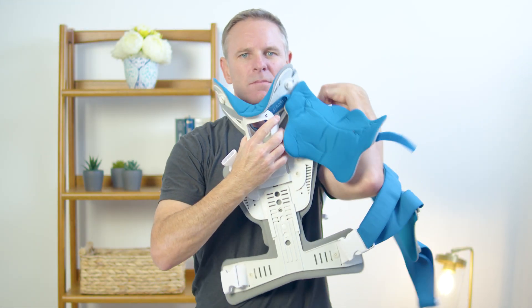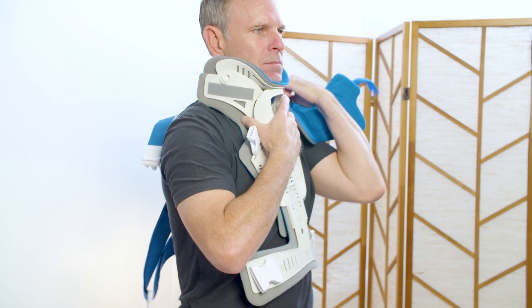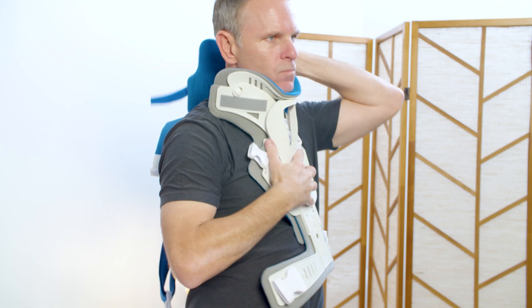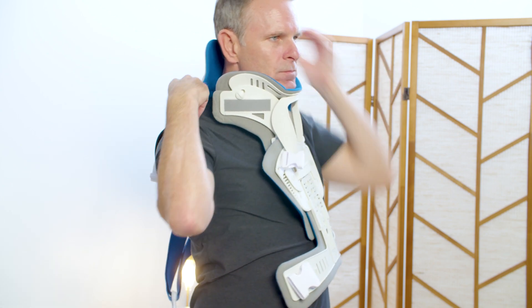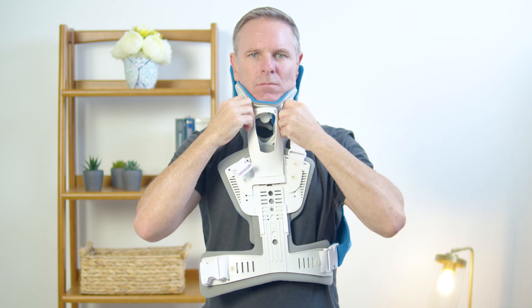Reach through both panels of the thoracic extension device, place the unfastened shoulder strap on the shoulder, and center the device on the body. Secure the cervical collar hook and loop strap and readjust until both straps are equal length.